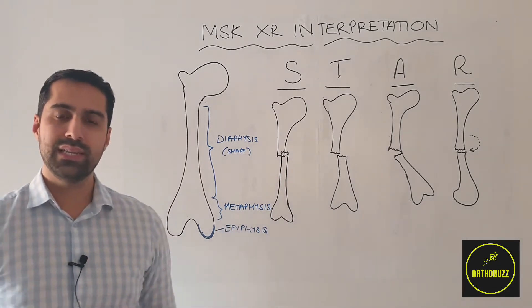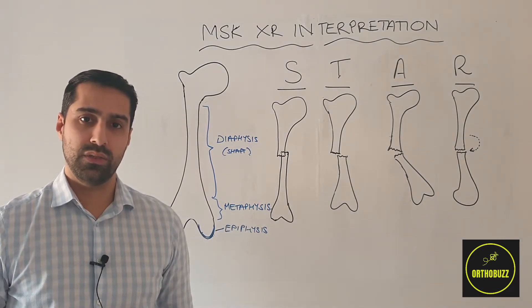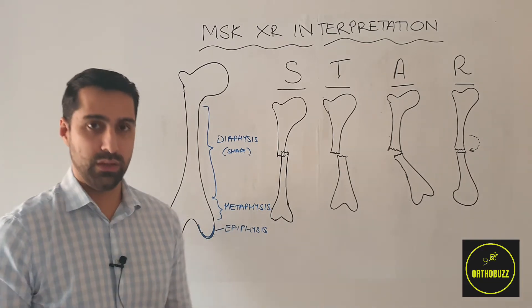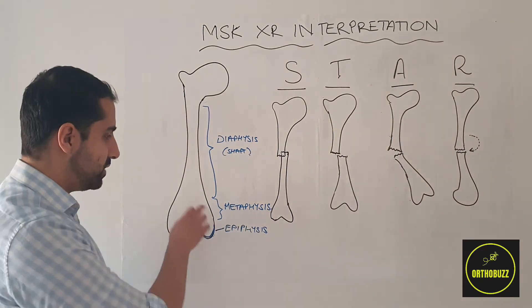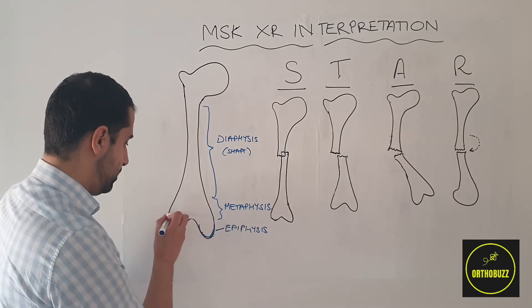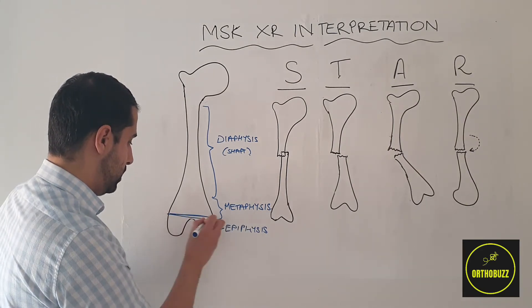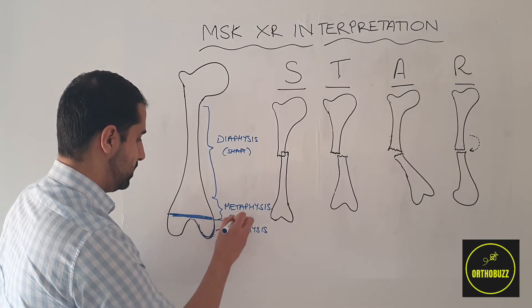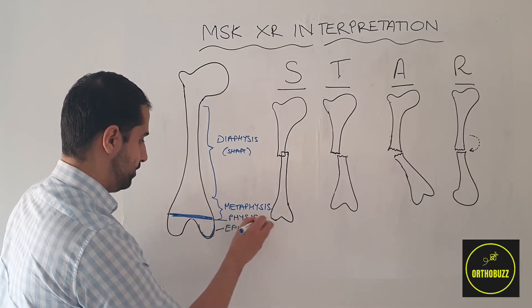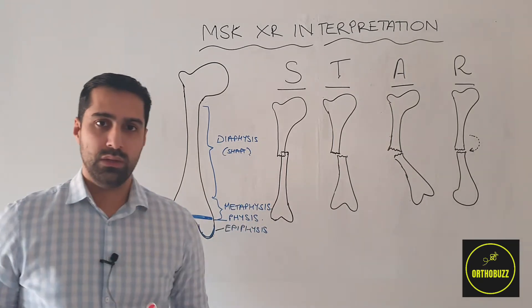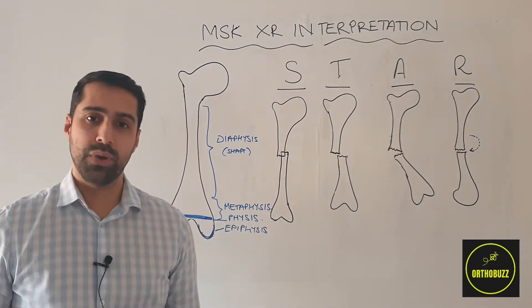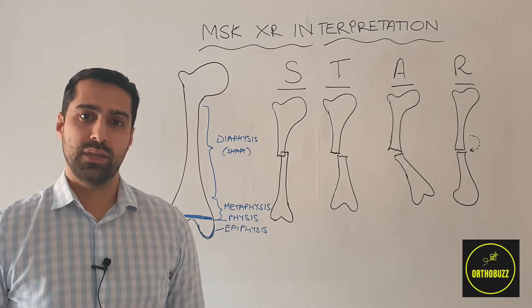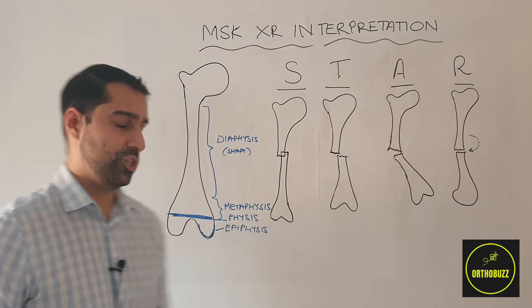In skeletally immature patients — those that are children — there will also be a transverse lucent area close to or between the epiphysis and the metaphysis. This is the growth plate, termed the physis. It appears lucent because it's composed of collagenous and cartilaginous tissue rather than calcified tissue.